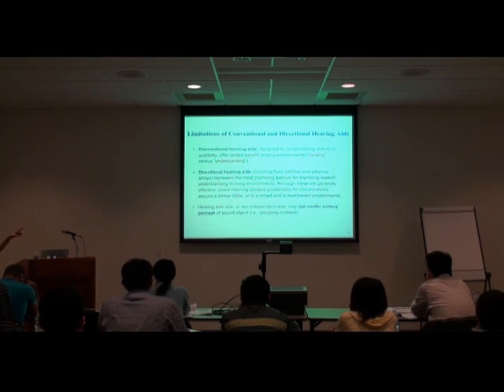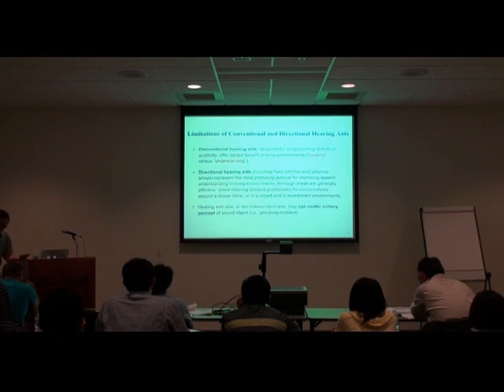So if you don't hear sound, let's say in the 5 to 7 kilohertz range, because of aging, or because you're overexposed to loud sound, loud music, wearing iPhone headphones all the time, you're going to have this deficit eventually, sooner or later, maybe sooner because of the headphone effect. And hearing aids generally offer limited help.